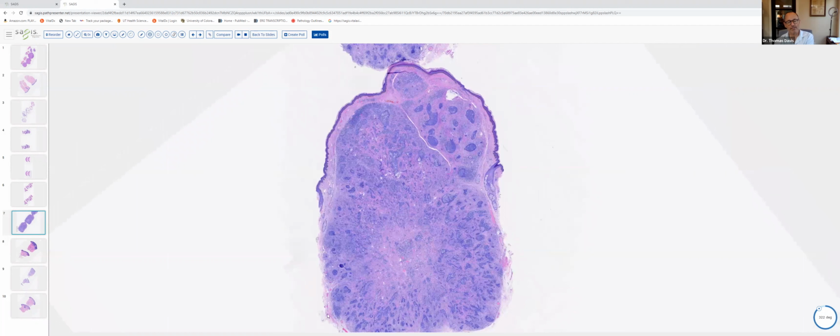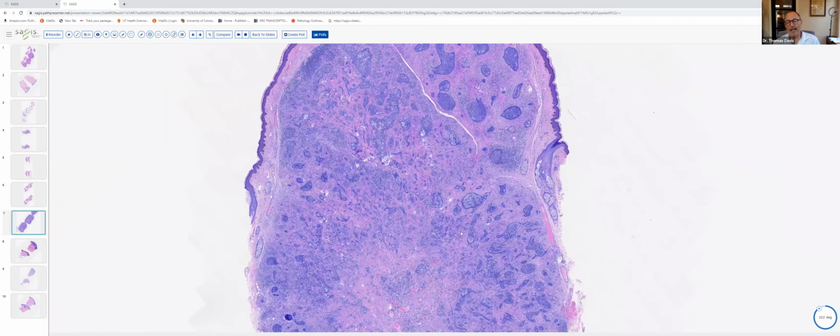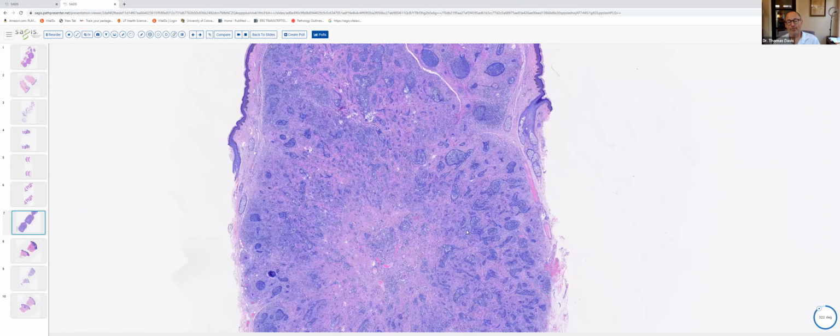And that is very common in epithelial-derived tumors showing follicular differentiation. So when I see an epithelial neoplasm with a prominent fibrotic stroma, I begin to think about the possibility of follicular tumors. Well, let's go on down and look at the epithelial aggregates.